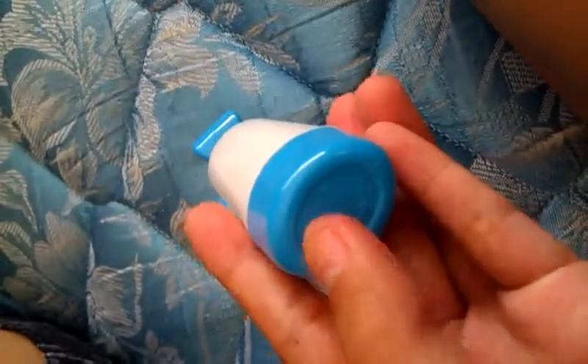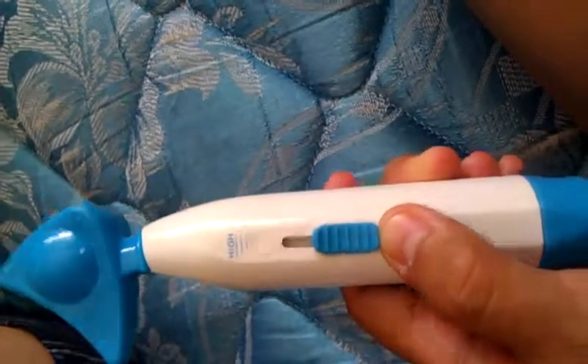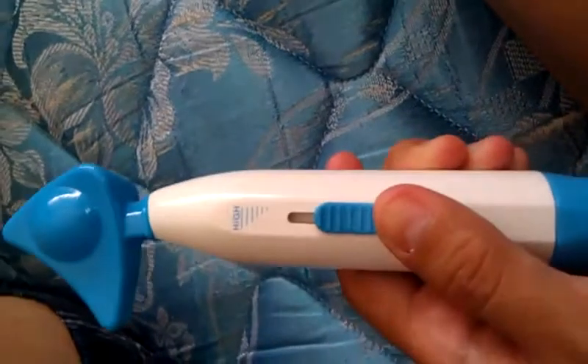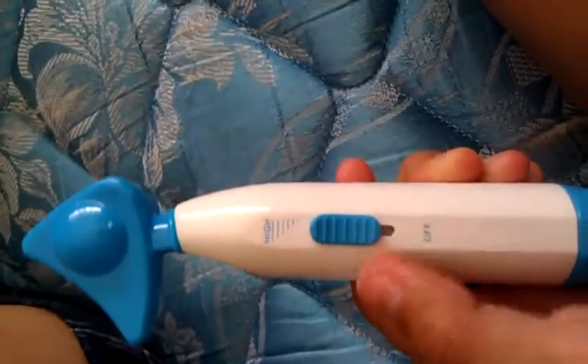You would put two AA batteries in here, then replace the cap. There's a lever to adjust the vibration — you want to start off slow and then increase as you go. It does get pretty intense as you move it up.